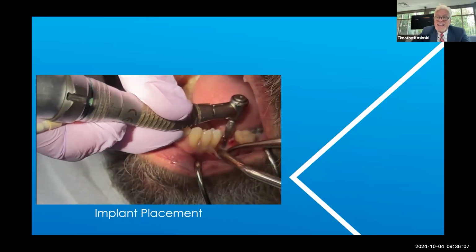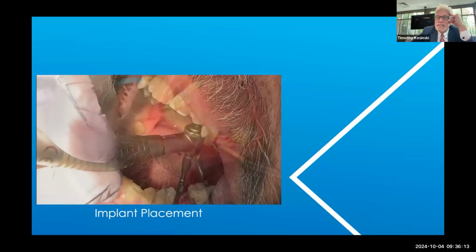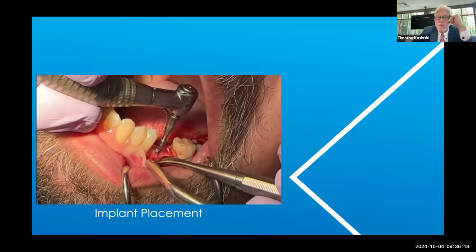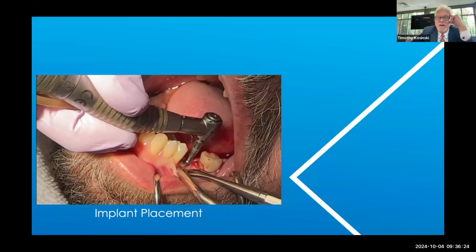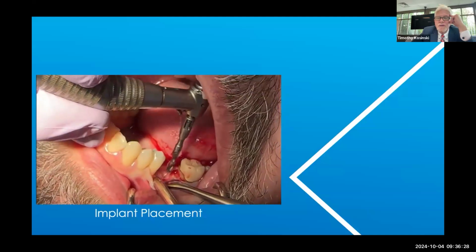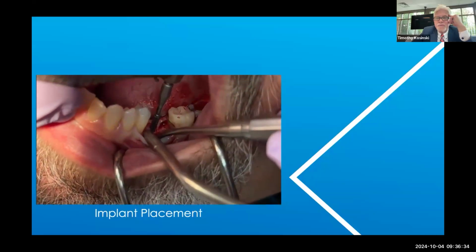This is a very safe surgical procedure. I'm using anatomy and CBCT diagnosis. Here's my 3.0 HT diameter burr, and you can see there's one line there. It's a very, very easy surgical procedure. You can harvest that viable bone from those sites if you prefer.